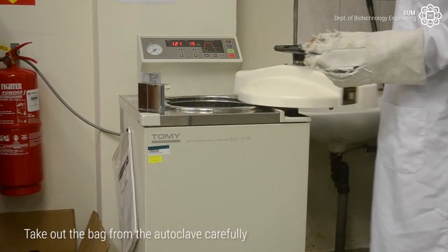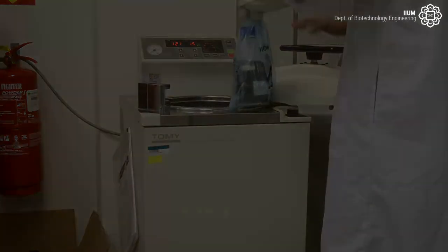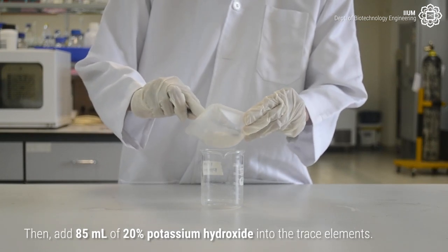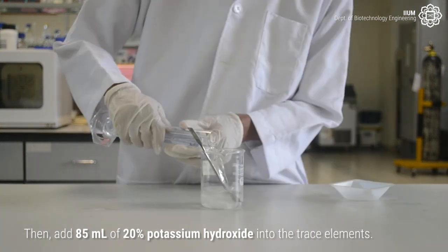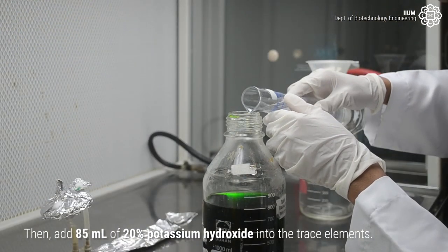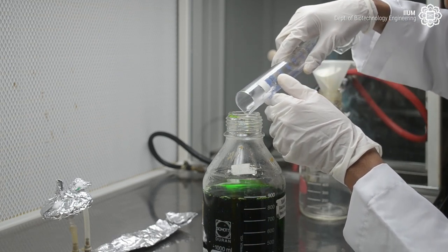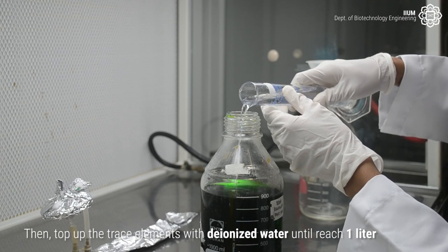Take out the bag from the autoclave carefully. Then add 85 milliliters of 20% potassium hydroxide into the trace elements. Then top up the trace elements until it reaches 1 litre.